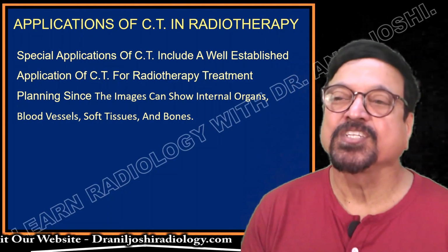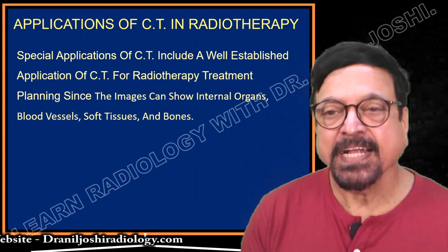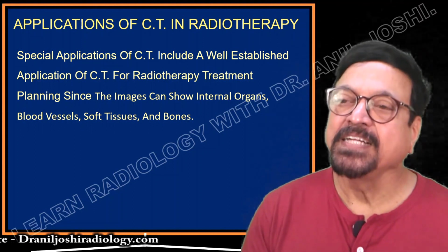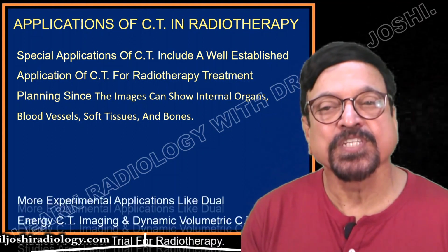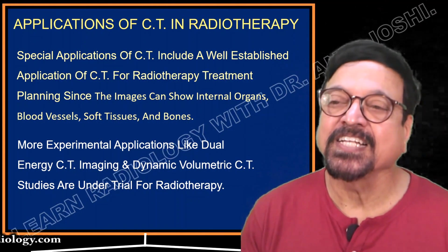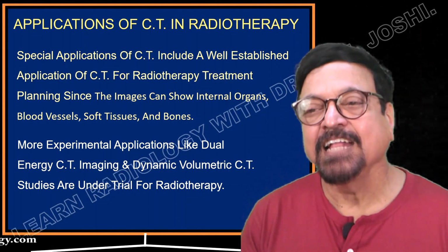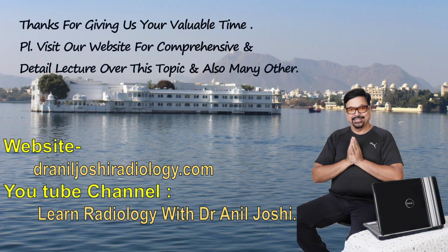Now special applications of CT include the well-established application of CT in radiotherapy treatment planning, since the images can show internal organs, blood vessels, soft tissues and bones, and you know which to save. More experimental applications like dual energy CT scanning and dynamic volumetric CT scanning studies are under trial for radiotherapy, and soon we will have results from them.